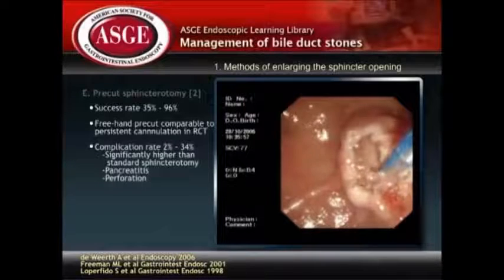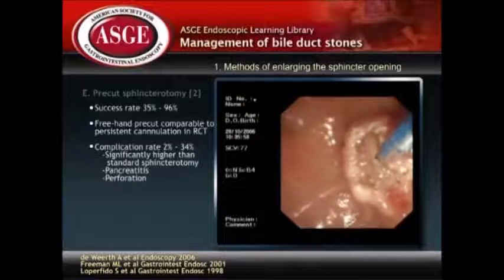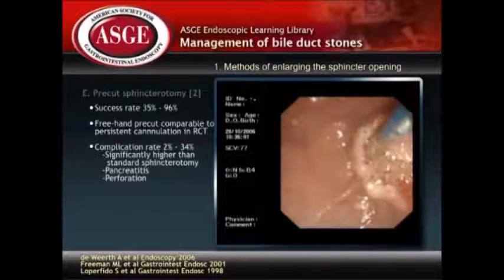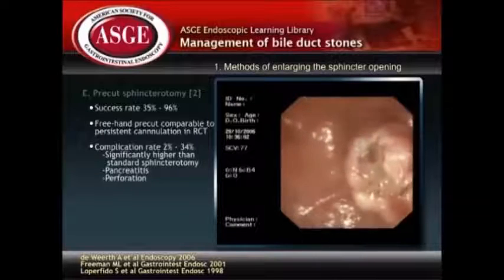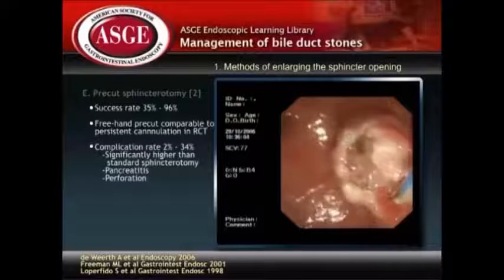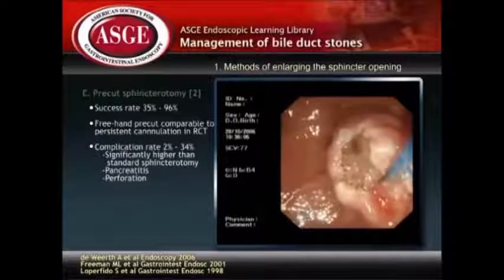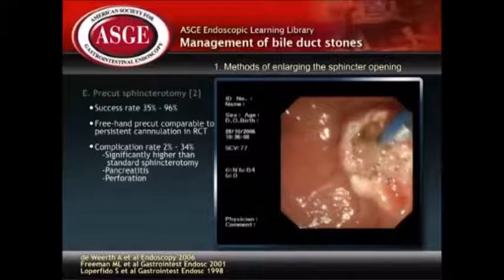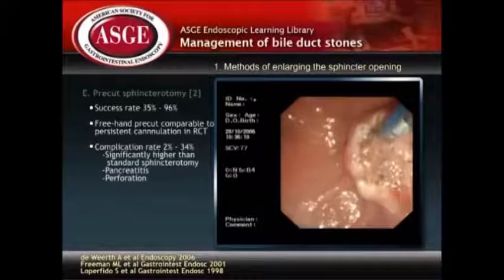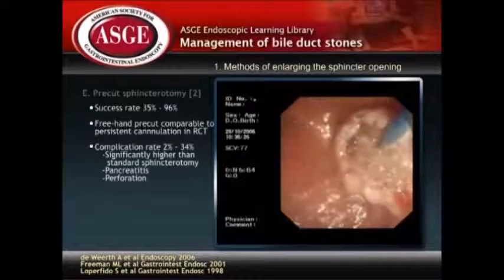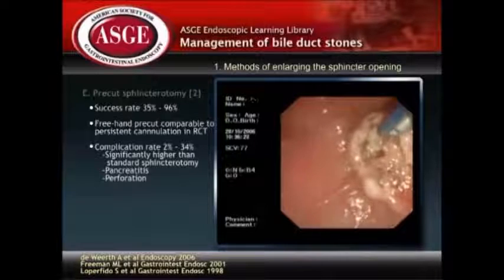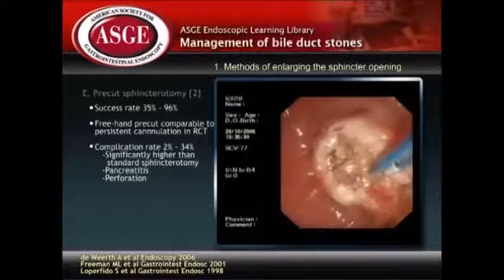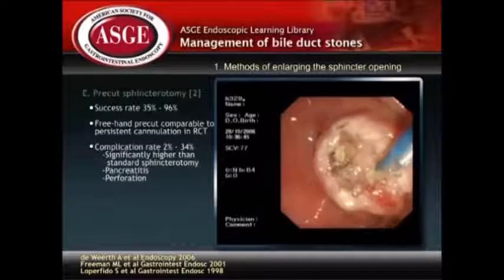This video demonstrates pre-cut sphincterotomy with the freehand needle knife technique. The incision began with the tip of the needle knife lodged at the papillary orifice. It was then extended upwards between 11 and 1 o'clock in a progressive manner to allow a step-by-step incision of the papillary sphincter.